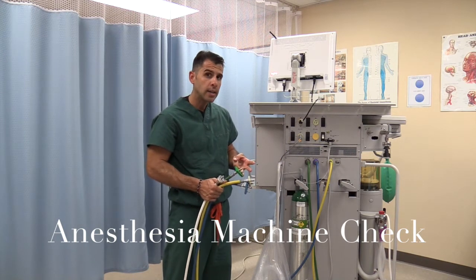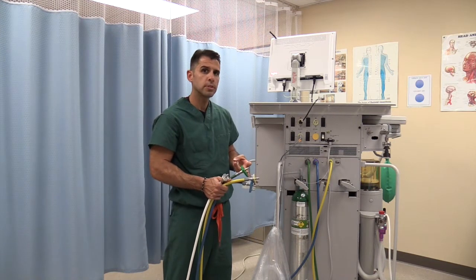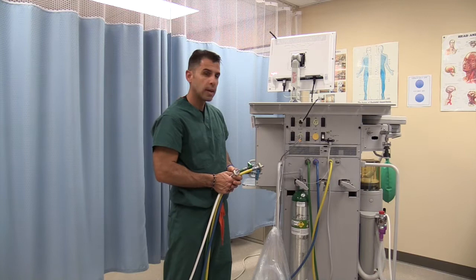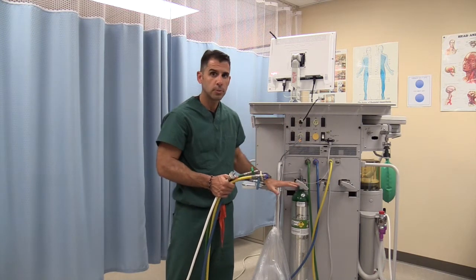You're going to be checking the high pressure system, intermediate pressure system, and low pressure system. The high pressure system is what I will be going over right now, which is the back of the anesthesia machine.